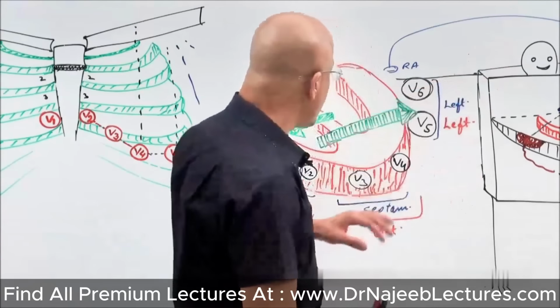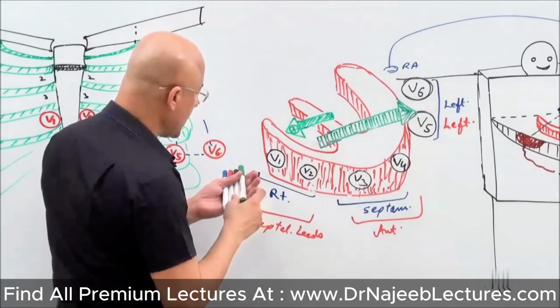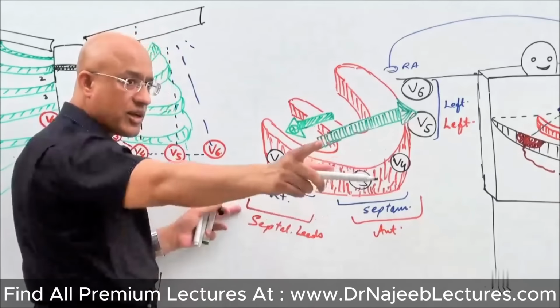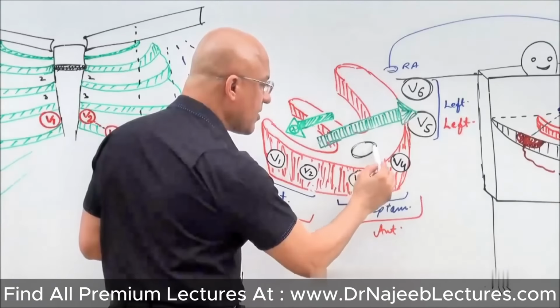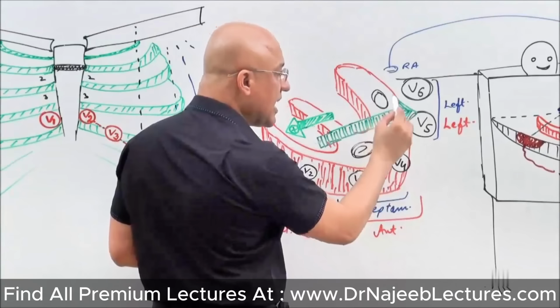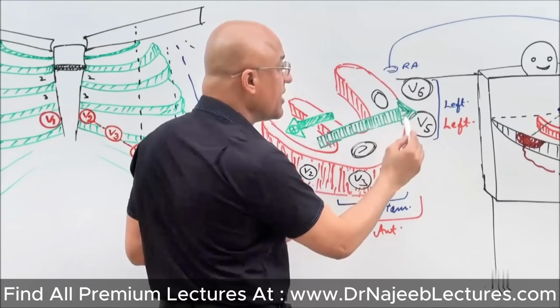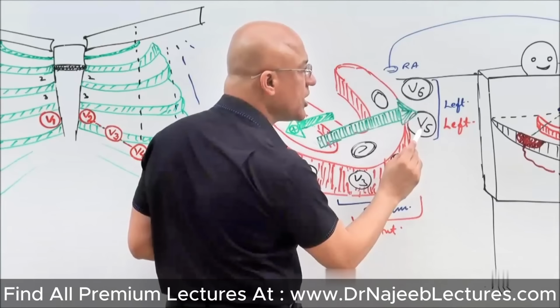Now, I will mention here, if myocardial infarction is in the septum, which leads are recording? V1, V2. If it is strictly anterior MI, which leads are recording the changes? V3 and V4. If there is left ventricular lateral wall MI, best ECG infarction changes will be seen in which leads?